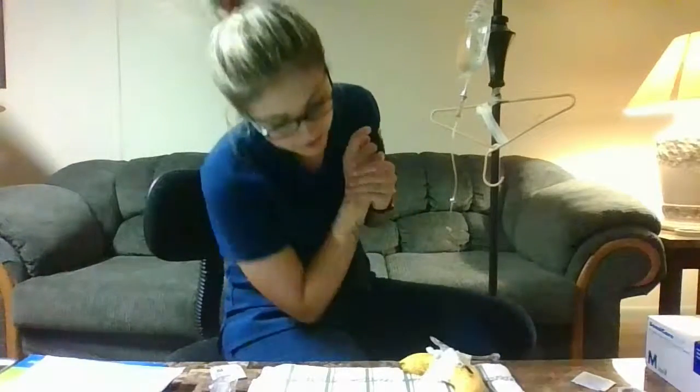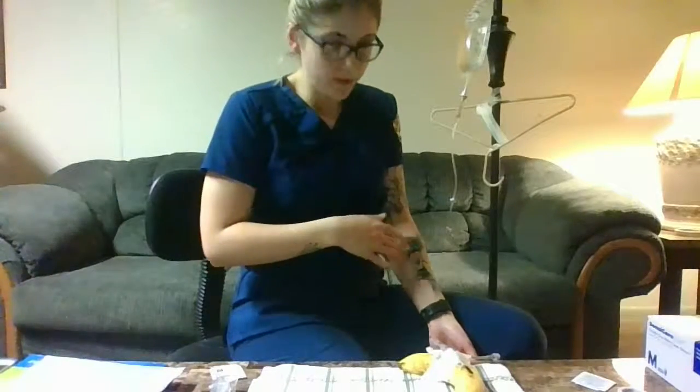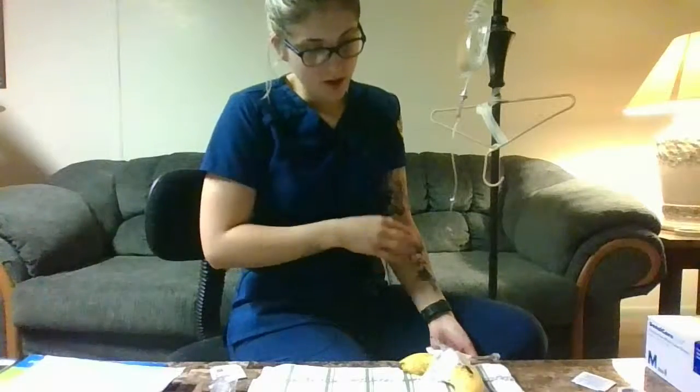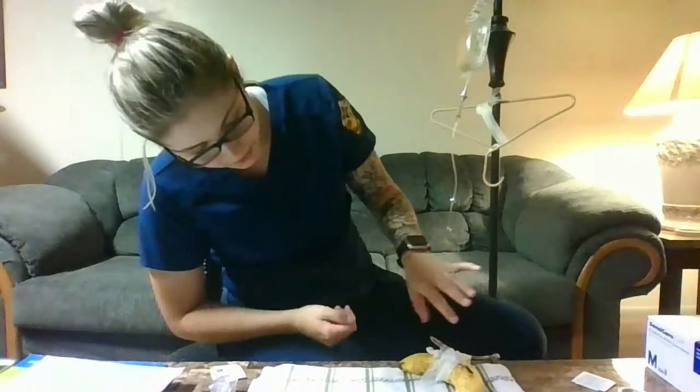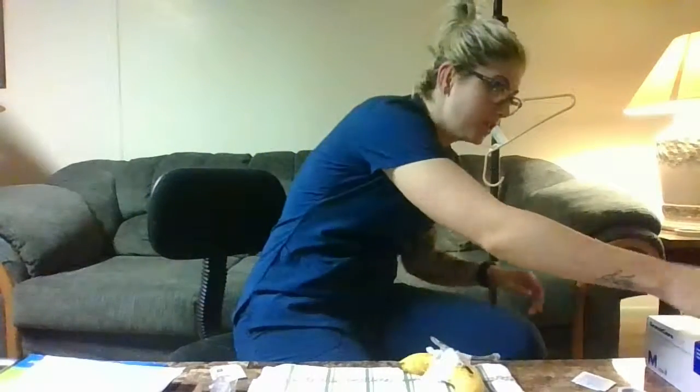You're going to wash your hands. You're going to look at this IV site. Make sure there's no inflammation, redness, pain. Make sure that that is all good there. And then, since we taped it up earlier, we're going to have to remove that tape. So washed our hands.